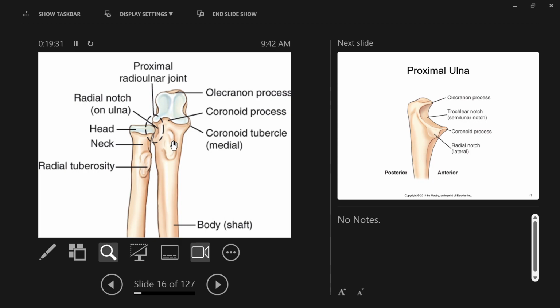Who's had experience with the elbow? Have you had people stuck in partial flexion? Yeah, this one girl, she had like a pillow on her chest and she just had it like this. Now, let me fast forward to the end of the exam. Did she have any fractures, any pathology? Was anything actually wrong? No. Okay. But could not go into full extension for you? What did the X-ray tech, or what did you do in that case? She angled the ray differently.